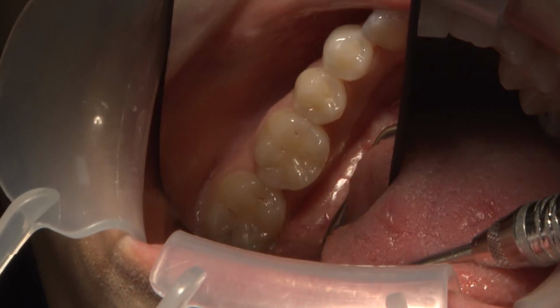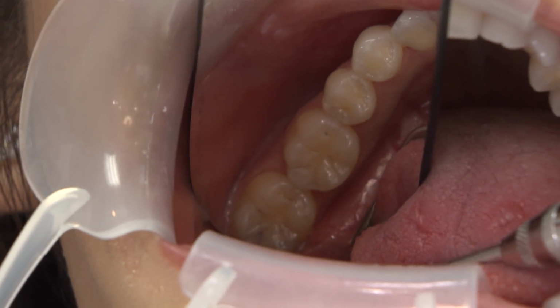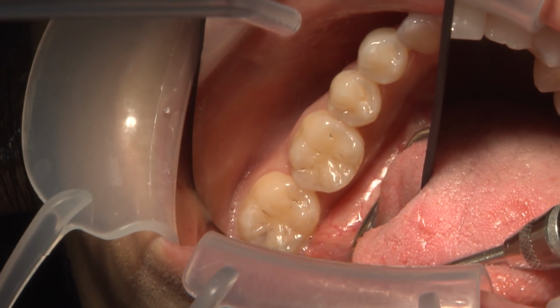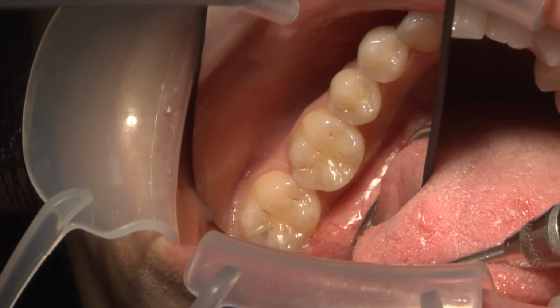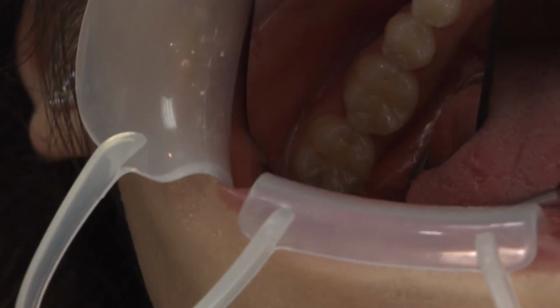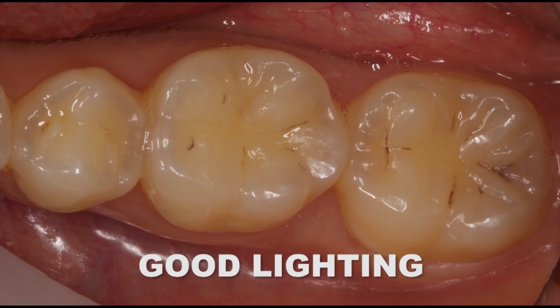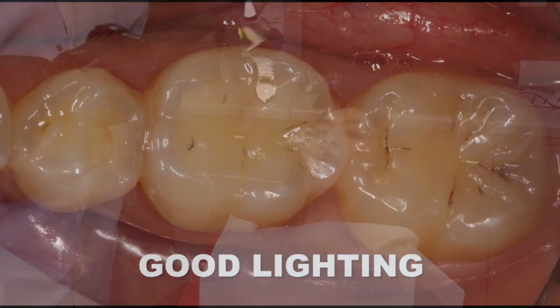Posterior shots may or may not need additional lighting depending on the quality of illumination from the camera flash. Test a couple images with and without additional outside light sources involved to find what works the best in each particular situation. Light reflecting off of the intraoral mirror may also cause distortions. Pay close attention to the focus of the external light beam and adjust accordingly to determine if light reflected off the mirror, direct illumination, or no external lighting at all will work the best.